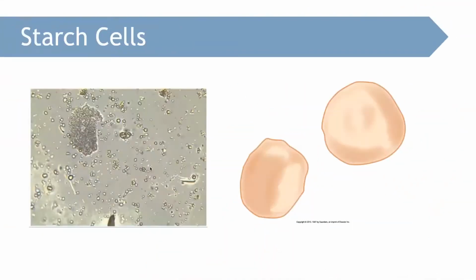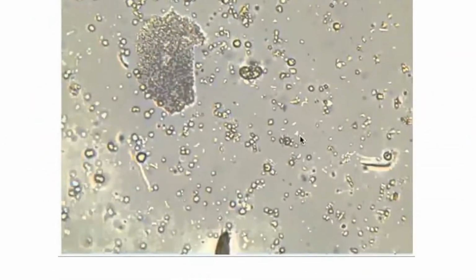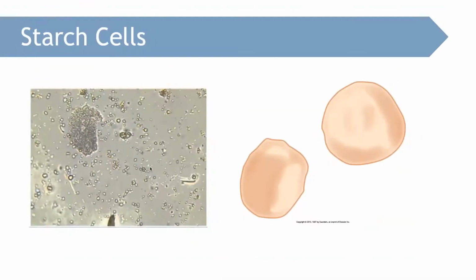Starch, like this. Students are always confused with this one. They think those round structures are red cells. No, red cells are bigger than that. We can also say this is bacteria, but it is too big. That is what we call plant or starch cells.